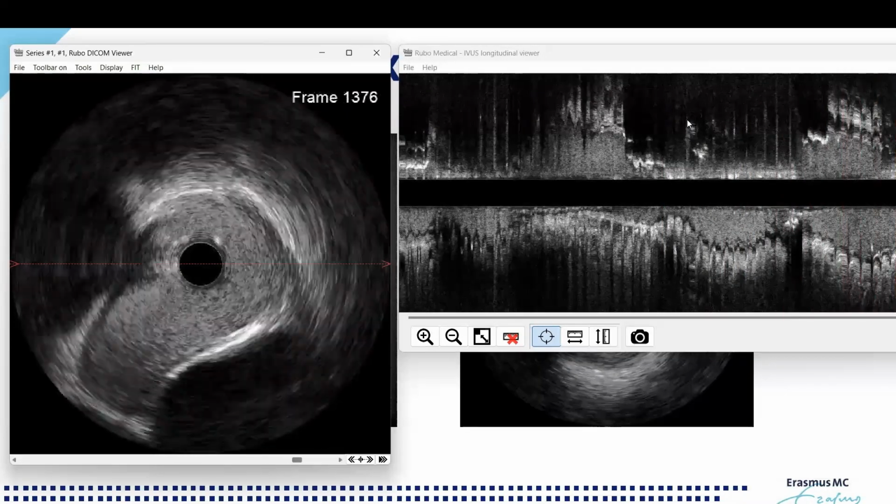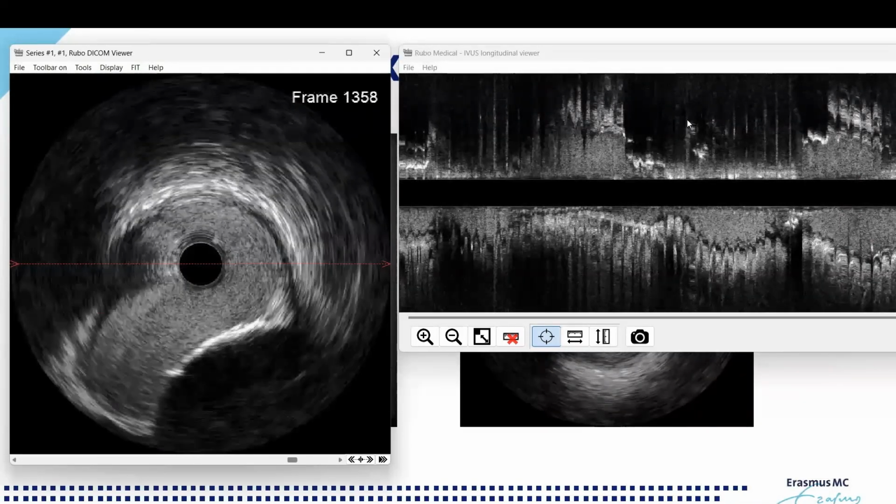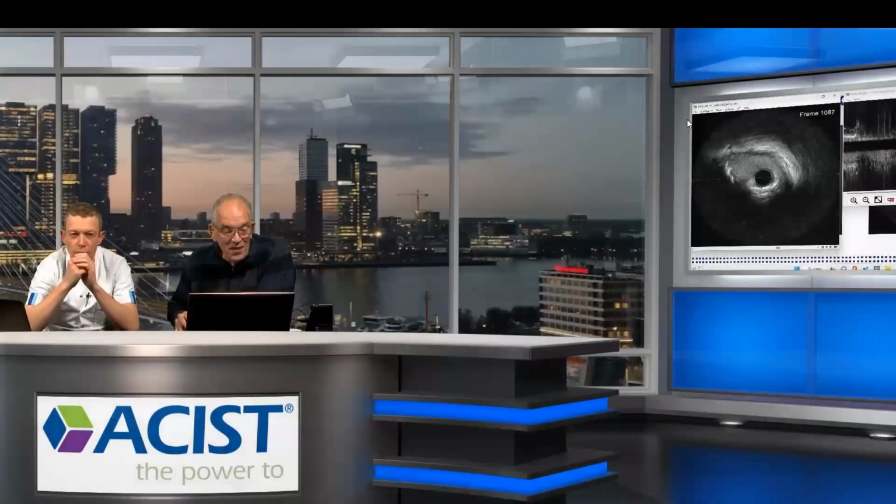In this case, this one is diffusely calcified. So this is interesting. Please remember the physiology. The FFR was normal, the RFR was borderline, 0.9, and the flow was abnormal, 1.9. That fits with the IVUS. Yeah, that fits with the IVUS.